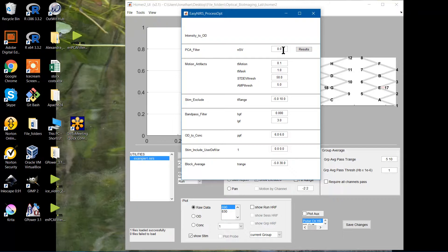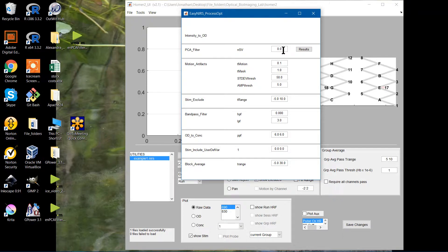If you use one integer, that number of components will be filtered from both wavelengths. So let's say I put a number 2, or an integer 2. For wavelength 1, I will remove two components. For wavelength 2, I will also remove two components.